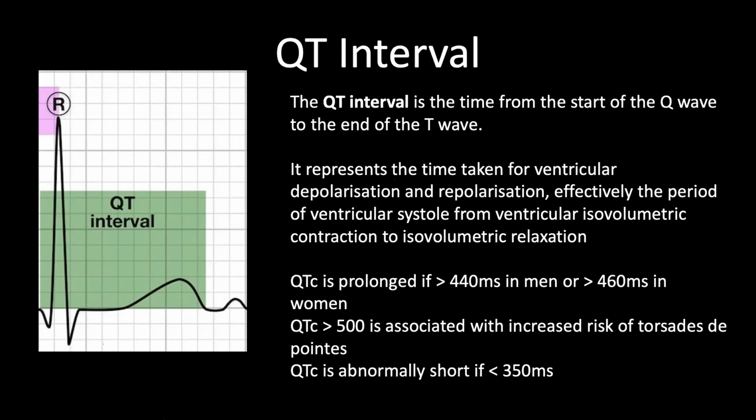Really important for sudden cardiac death. There are lots of syndromes related to that, so prolonged QT, and thinking of torsades, and lots of other conditions that cause prolonged QT. You can also get short QT and very short QT. All of these are associated with sudden cardiac death in young people. It's really important that if you're spotting either a long or a short QT, you think about the risks associated with it. The ultimate risk with a long or short QT is that it puts you at risk of ventricular abnormalities and arrhythmias, particularly VF and VT, which are never good arrhythmias to have.